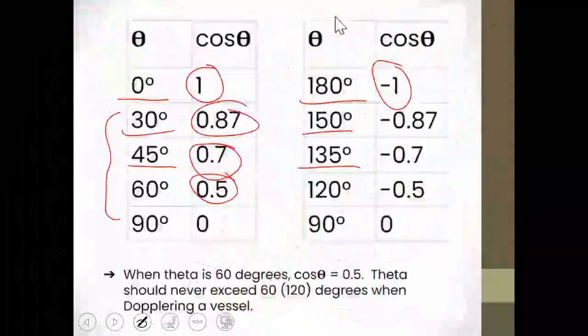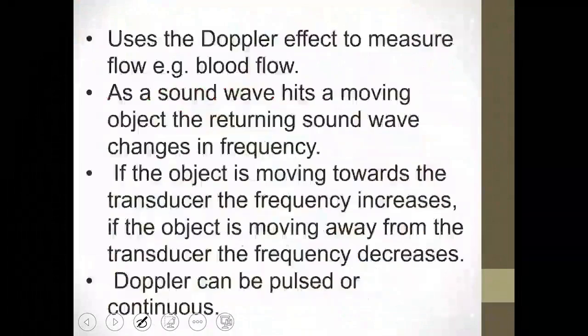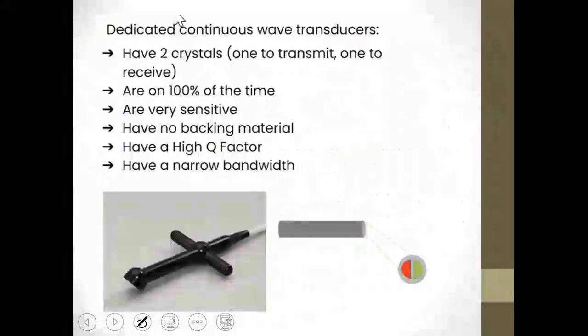We are now talking about Doppler. There is a need for two types called continuous wave Doppler and pulsed wave Doppler.